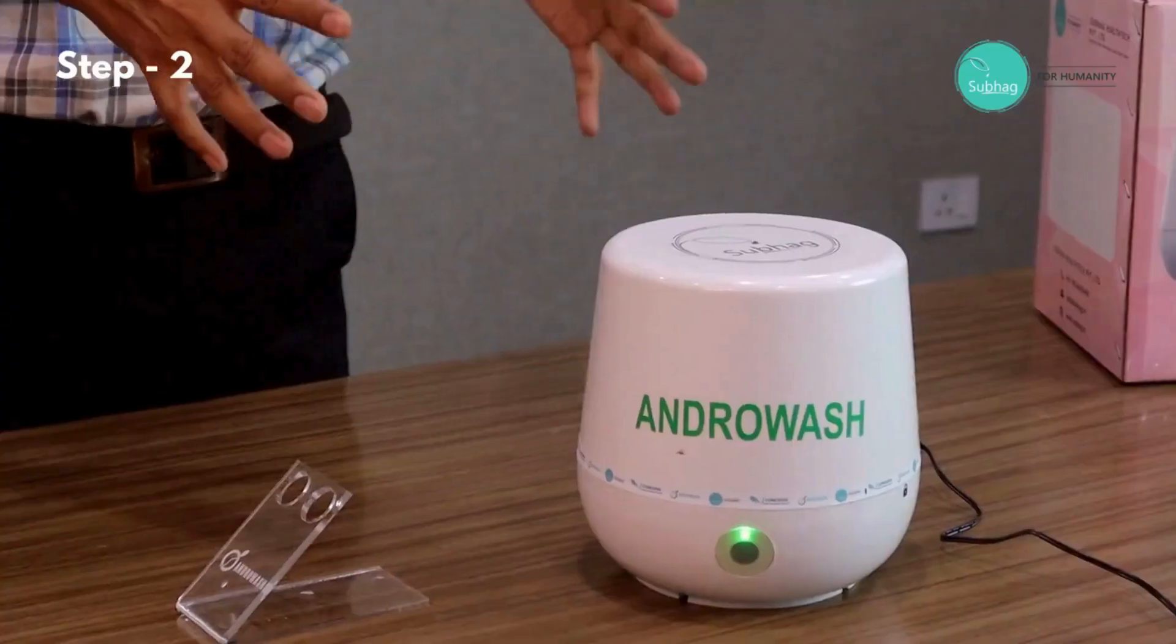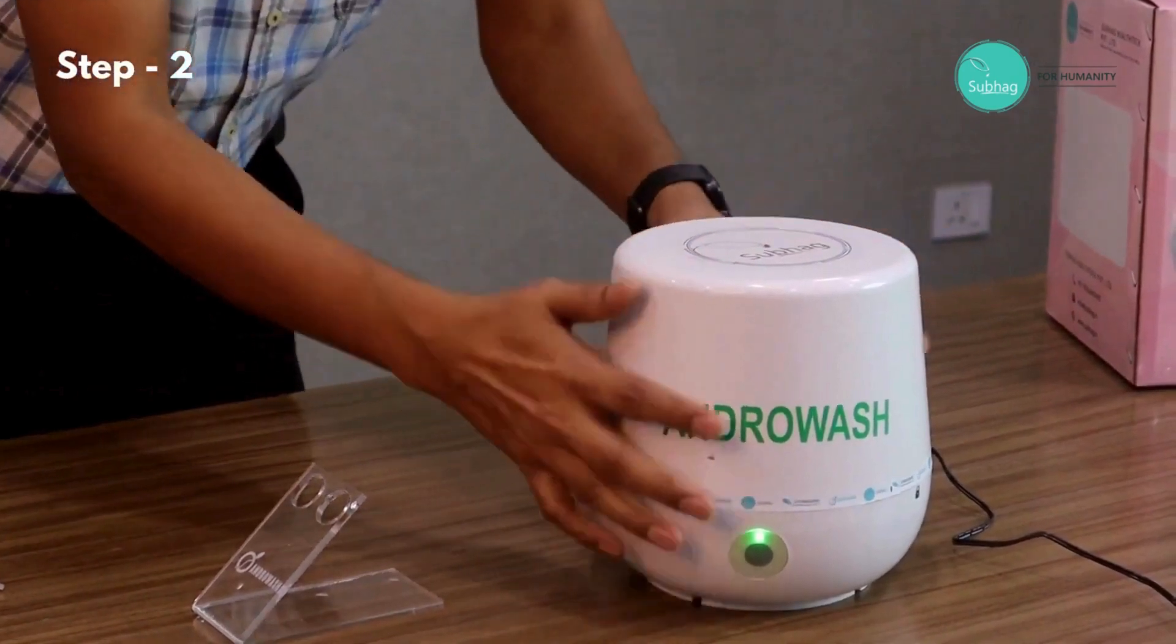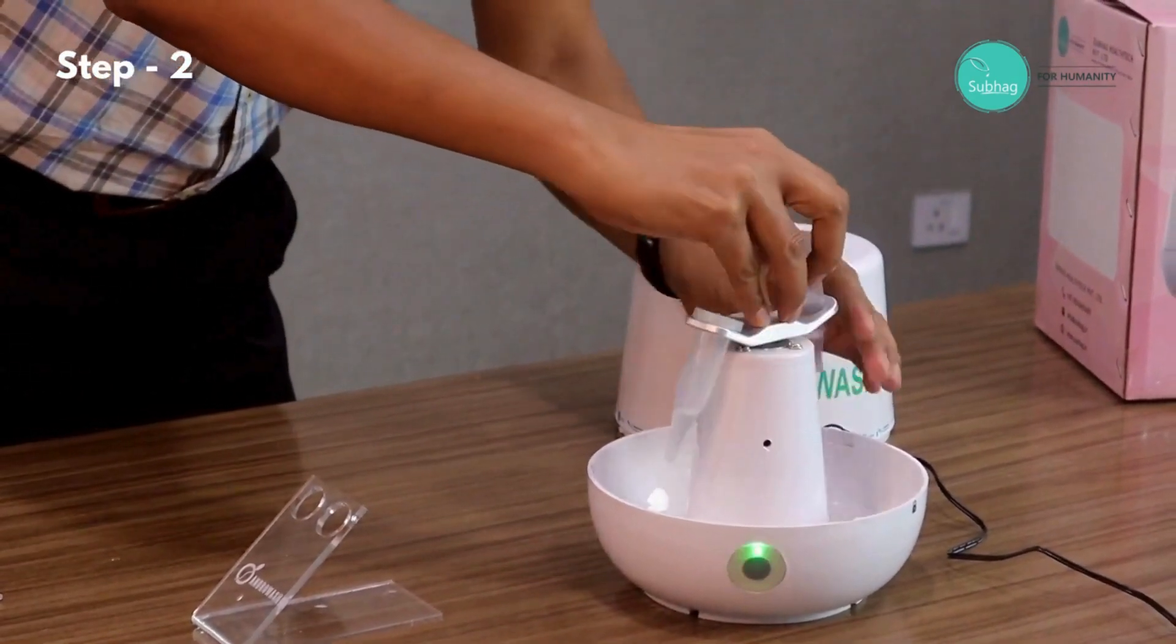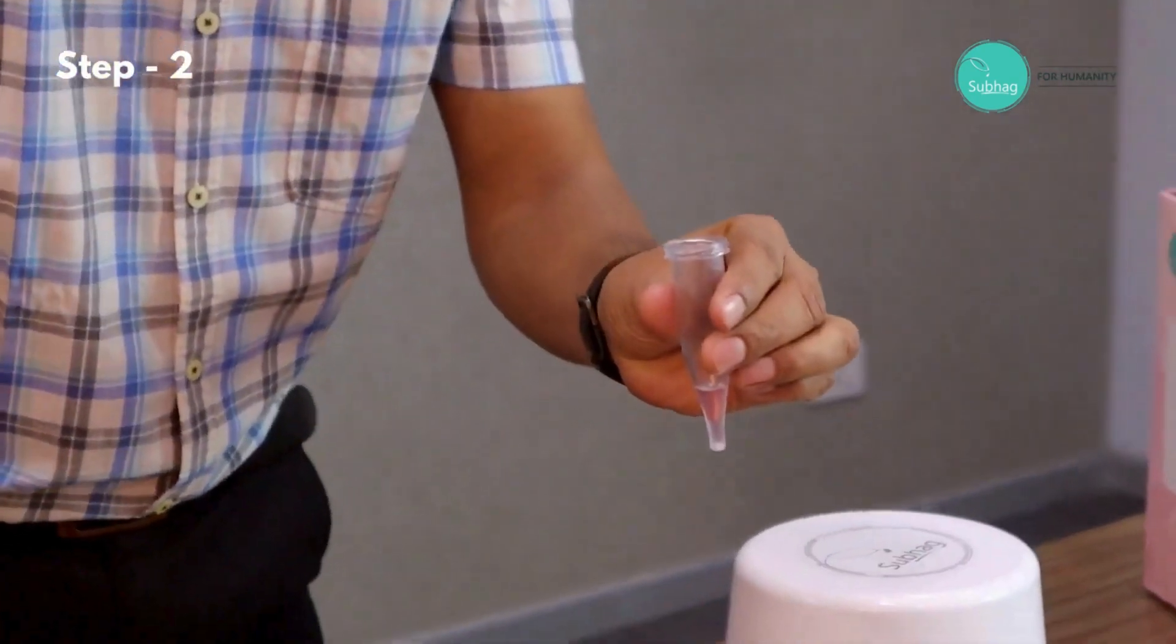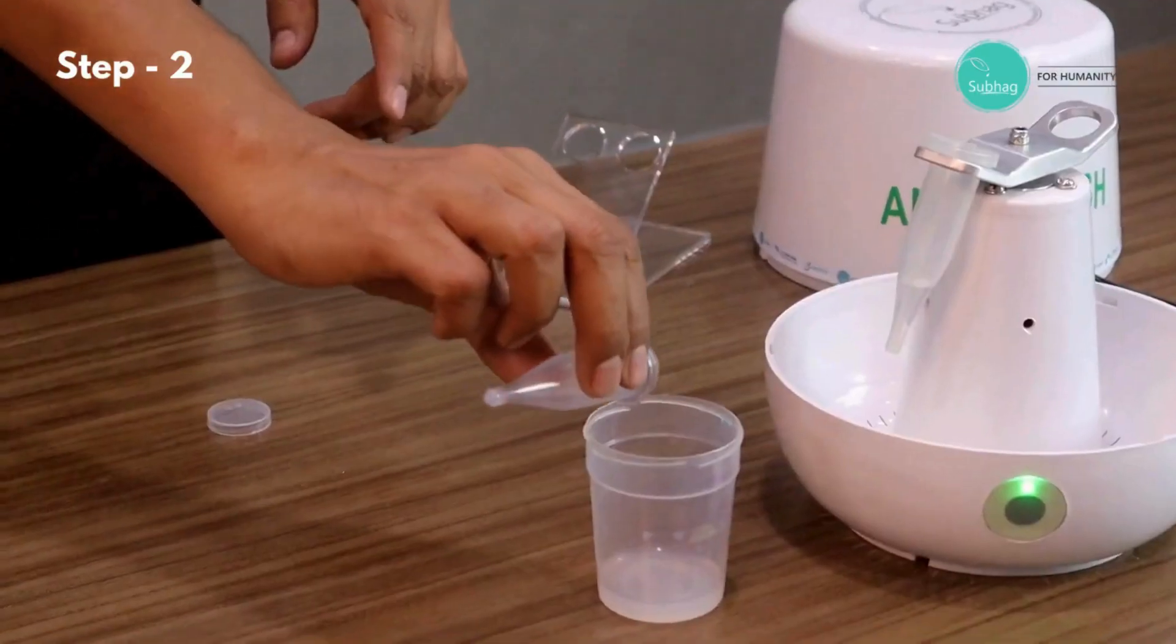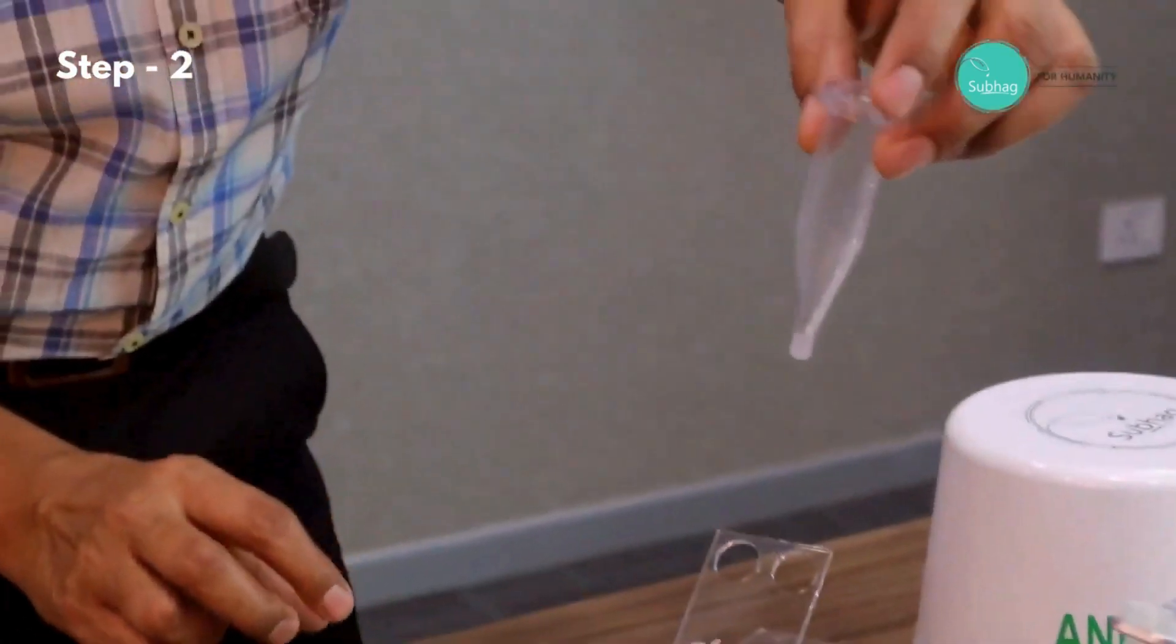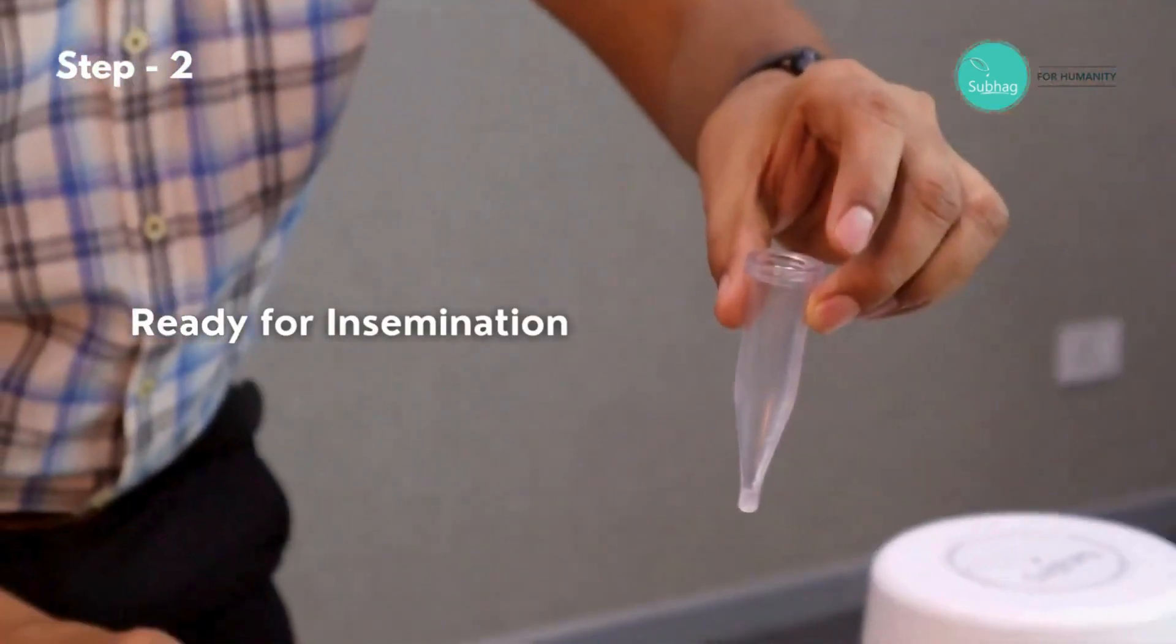Now this second stage washing is complete. We will remove the cap and then take the tube with the semen sample. Now we need to simply discard the supernatant just by tilting the tube like this, and we can simply discard this.